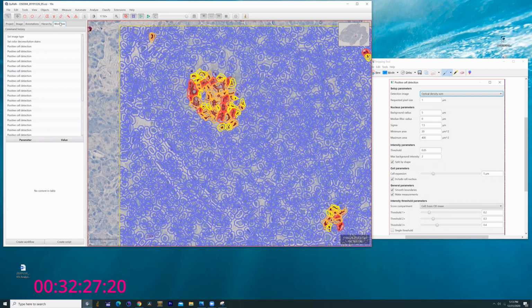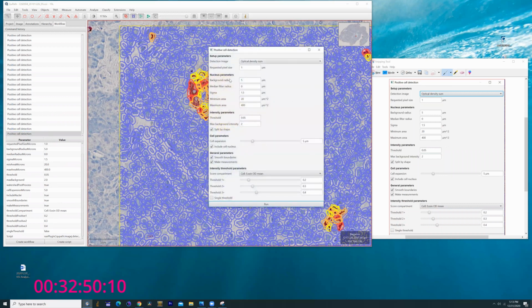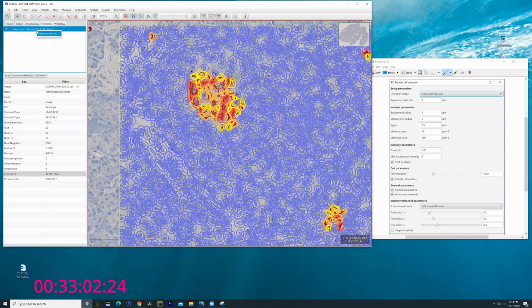A second option, if you ever lose your information, is that every step you've done here is actually stored in your history workflow. The one at the bottom is the most recent one, and that's going to have all of your threshold and boundary data plugged in. So I click on this. There you go. There's your number. It's already stored. The issue is just knowing where you're going to find it in the workflow. But in this case, since it was the last thing you did, it's not quite so difficult. But anyway, let's go back to the hierarchy. Let's delete the file.